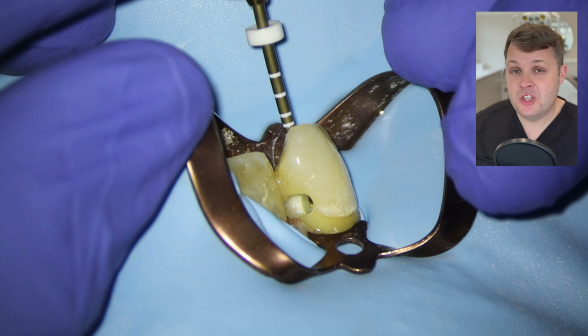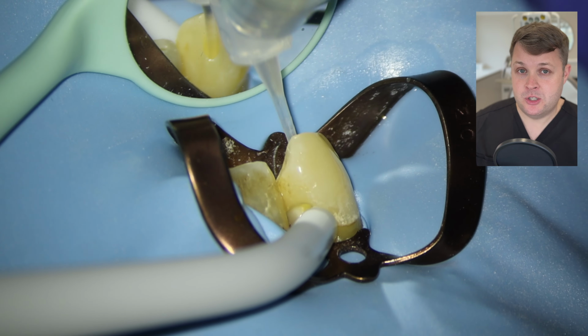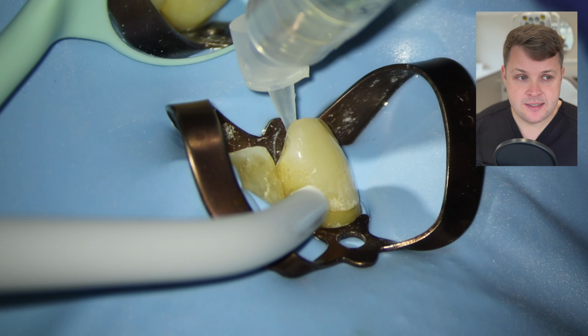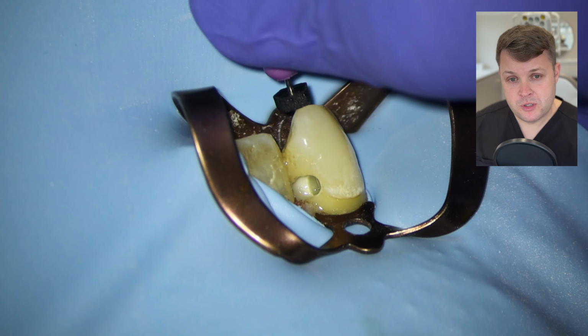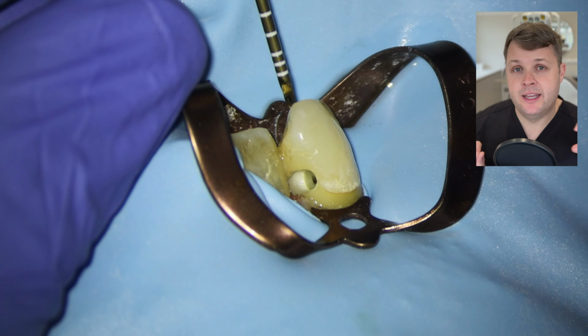Now, what I do is I just get a really large tapered GP cone, say a size 45.06. It'll be 45 at the tip, but for every millimeter it goes up by 6%. And if anybody knows anything about compounding interest or compounding values, when it reaches the top of the GP cone, it's rather quite thick.